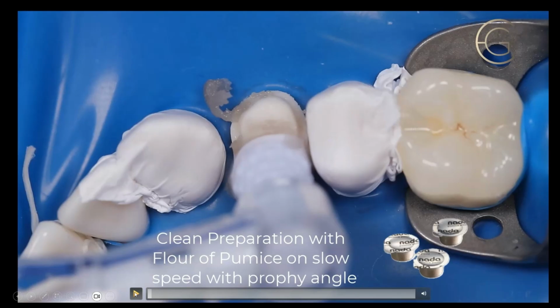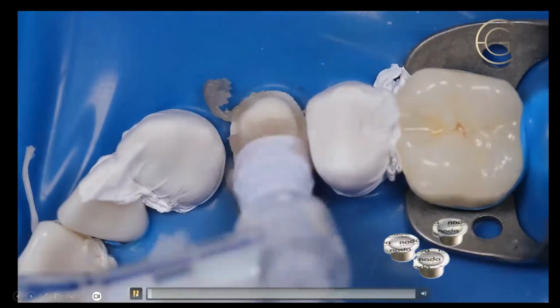I actually do put a rubber dam on when I'm using Teflon tape. Now, the Teflon tape, I run through the sterilizer. I make 8-inch strips, and I have them. I use a lot of Teflon. It's great for tissue control and stopping bleeding. It's also for the adjacent tooth. So I love this. You can use the pumice as well.